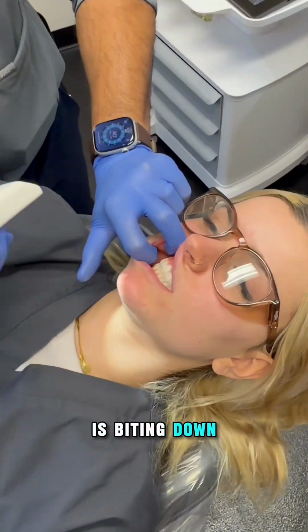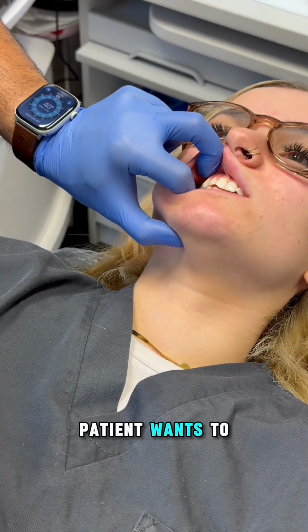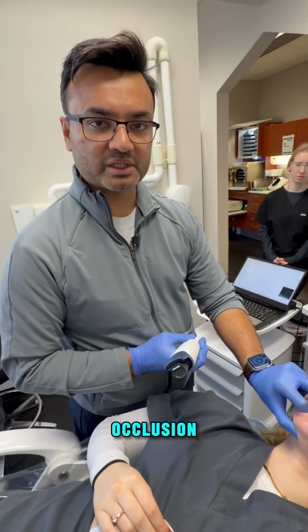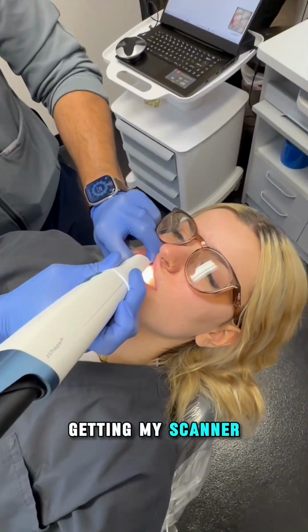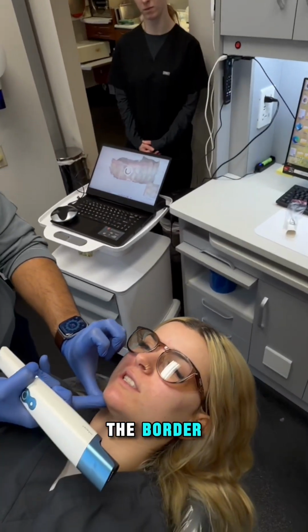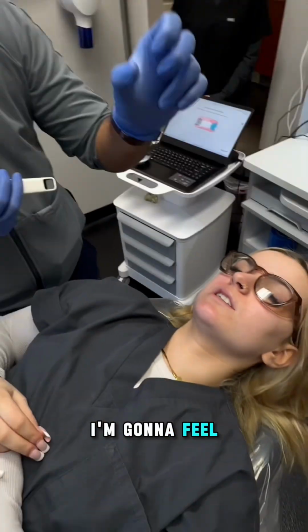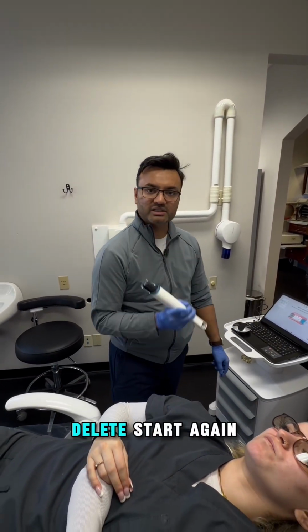While the patient is biting down, my thumb here is holding the mandible so that in the event the patient wants to move, I would feel it right away that there is movement from the occlusion. Again, little things matter. So now I'm getting my scanner in, 2 fingers retracting, and my thumb is constantly at the border of the mandible, so that any micro movement, I'm going to feel it and I know that my occlusion will be inaccurate. So I'm going to delete, start again.